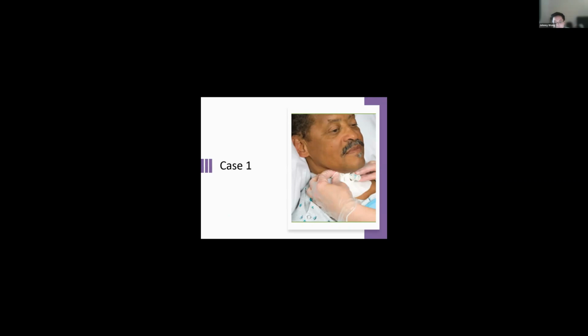So a patient comes in post-op day 3. The tech was just cleaning him and noticed that the trach popped out a little bit. She just pushed it back in, and shortly after, they noticed respiratory stress and that it was difficult to ventilate. You could type in the chat what you think maybe happened.